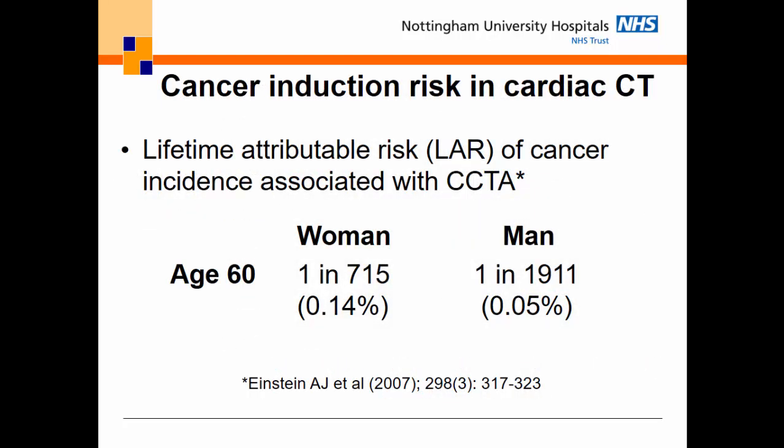Okay, so Einstein came up with these figures. Really, this is from the relatively early days of CT, and suggested that the risk of cancer associated with the doses from cardiac CT are about this level. So for a man, 1 in just under 2,000, and for a woman, just over 1 in 700. Okay, the doses have come down significantly from that value, but it's that sort of risk that you're thinking about. It's not trivial. Okay, so you've got to think about whether the patient really needs this scan or not.